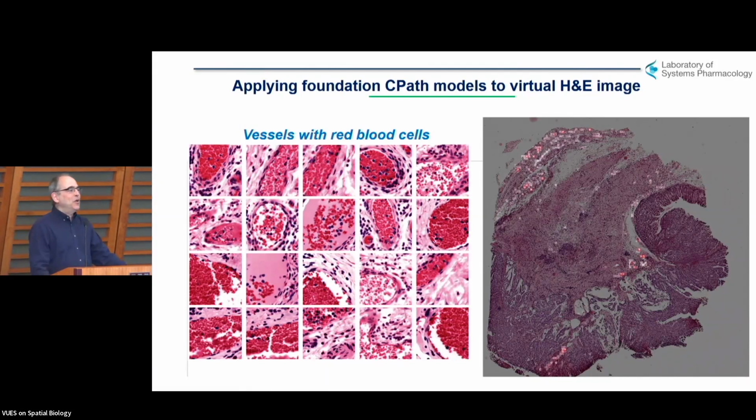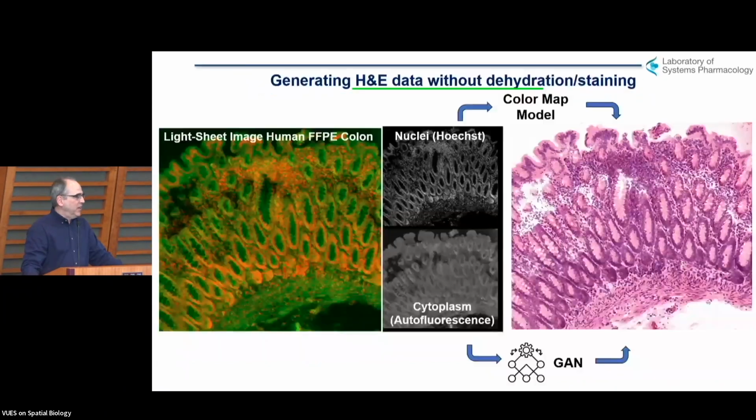And in fact, if you go back and take a high dimensional image of the type I've shown you, and you say, what fraction of the cells there are never identified by any contemporary algorithm? It's between 10 and 30%. And so actually this older fashioned type of H&E data contains a huge amount of information about cell types. Admittedly, it's sort of this type, but if we can recognize that with classifiers, we'll be able to add it to our single cell data set.